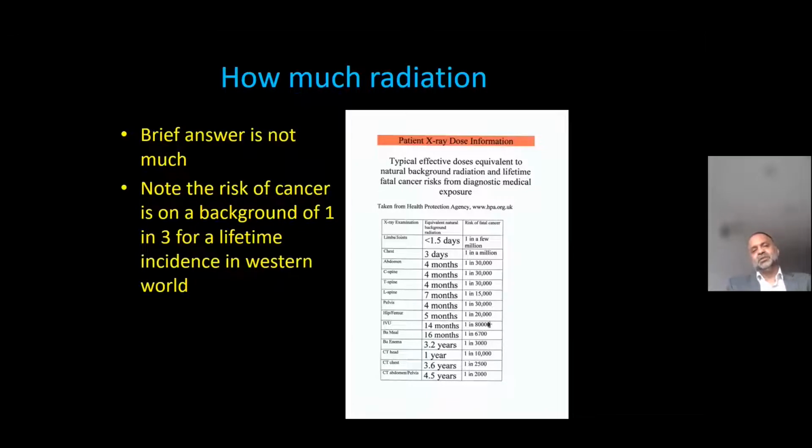Now, when we do these procedures, how much radiation do we give to our patients? This is primarily for the patients. Briefly, it is not a lot of radiation, certainly for the procedures that we do and the way we plan our radiation exposure for the patient.